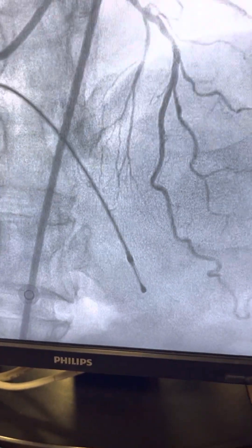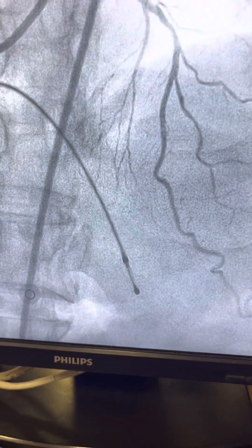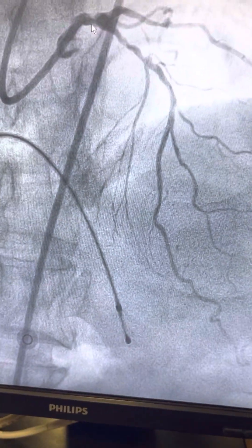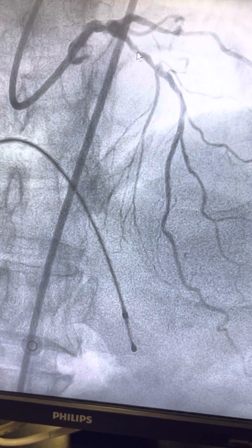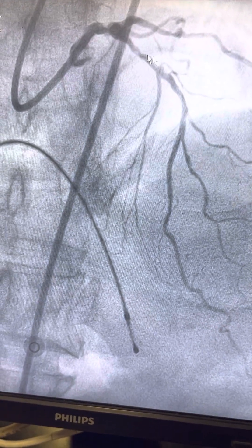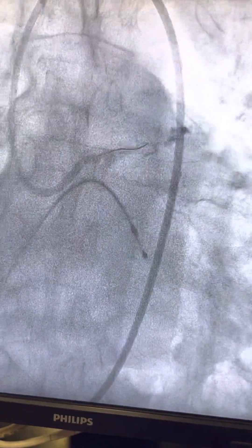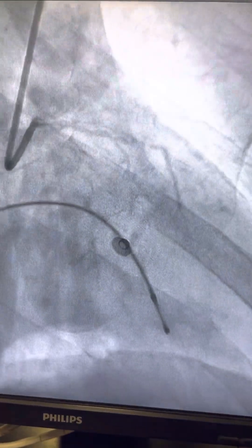In different views I can show you — there is left main disease here, and there's a 90% lesion here. You can see there is a very narrow channel. These are the pre-procedure angiograms.